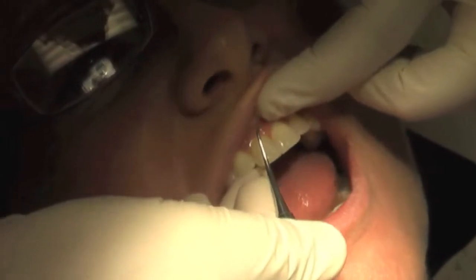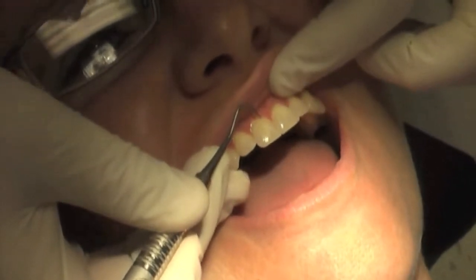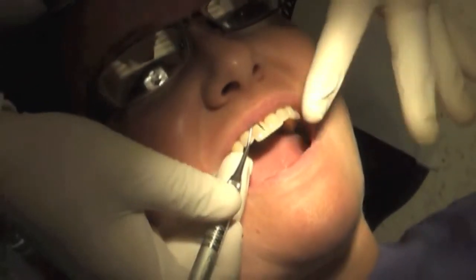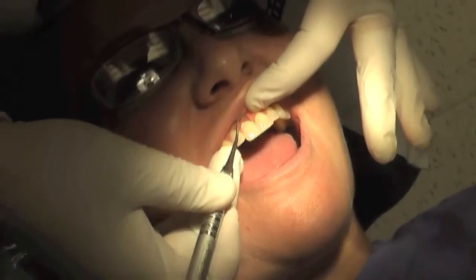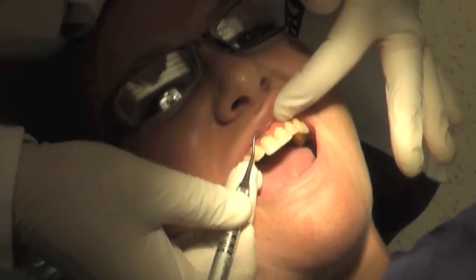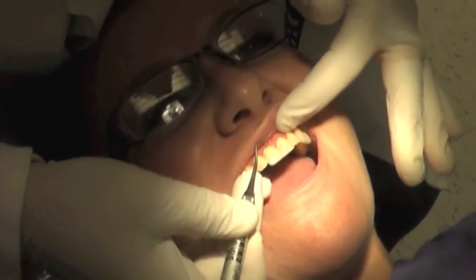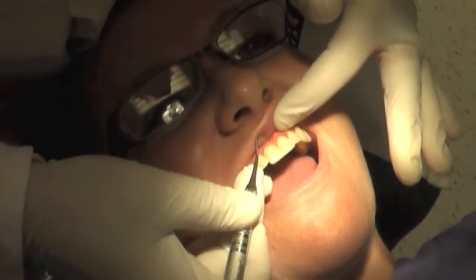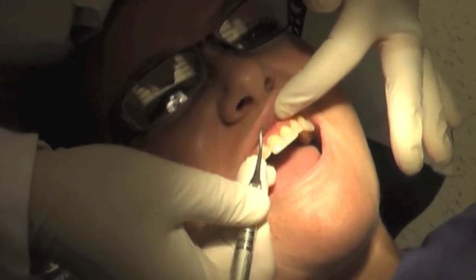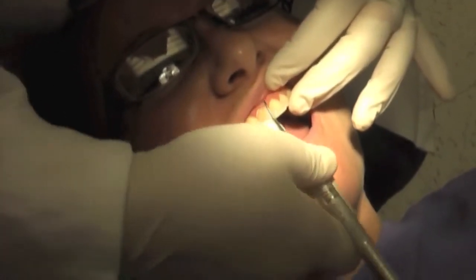On the whole, I'm pretty straight up and down. We see a lot of incorrect adaptation when you go flat on your fulcrum. This really happens quite a bit where a student starts like this and comes around. What's wrong with that? I'm not perpendicular. Why is that a problem? You're going to poke the patient — which they're not going to be happy about — and you're going to miss deposit. If I'm angled like this, I might get deposit just slightly under the gingiva, but what about deposit right here? A patient like Marcy with amazing gingiva won't have a piece there, but the issue remains.